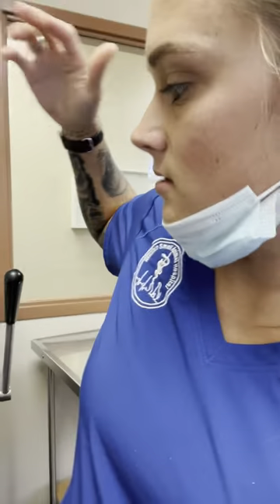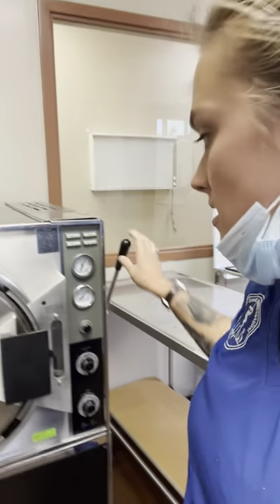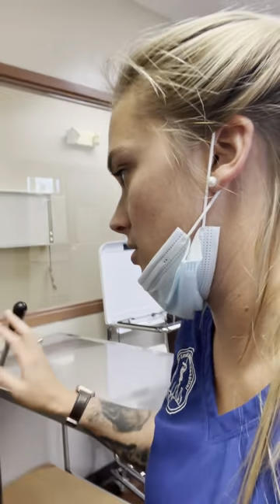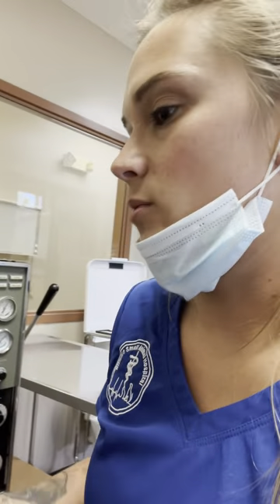Fill it to there, get it all set. When this is done it alarms super loud, and you're going to flip the function button to vent so the pressure will vent out. Once all your pressure is out it'll tell you that you can open the door. Hold this button in, pull that release handle to unlock it, then open it — and it is very hot, so when you open it just stand back because steam will come out.